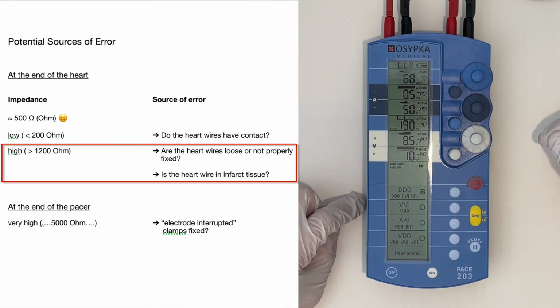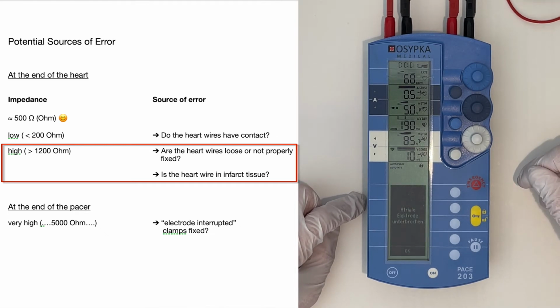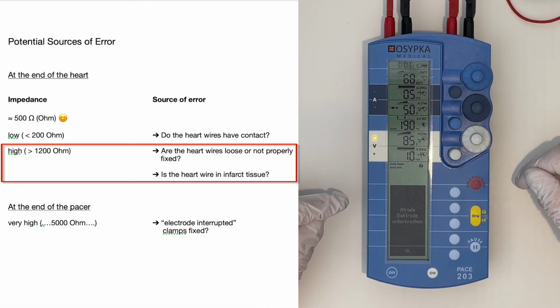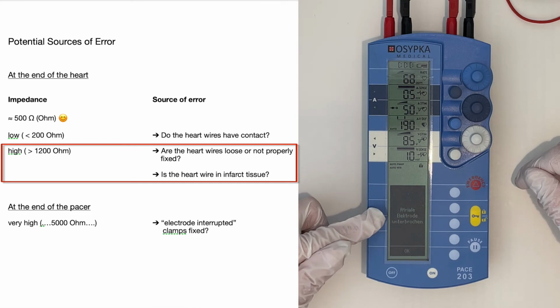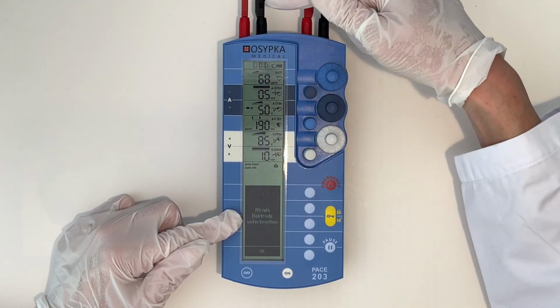If the impedance is high, so more than 1,200 ohms, it probably means that the heart wire is not properly anchored in the muscle tissue, or that the heart wire may have been placed in infarct-damaged tissue, where conductivity is not very good. If you see very high impedance values in the order of 5,000 ohms, then the message "electrode disconnected" is shown on the display.